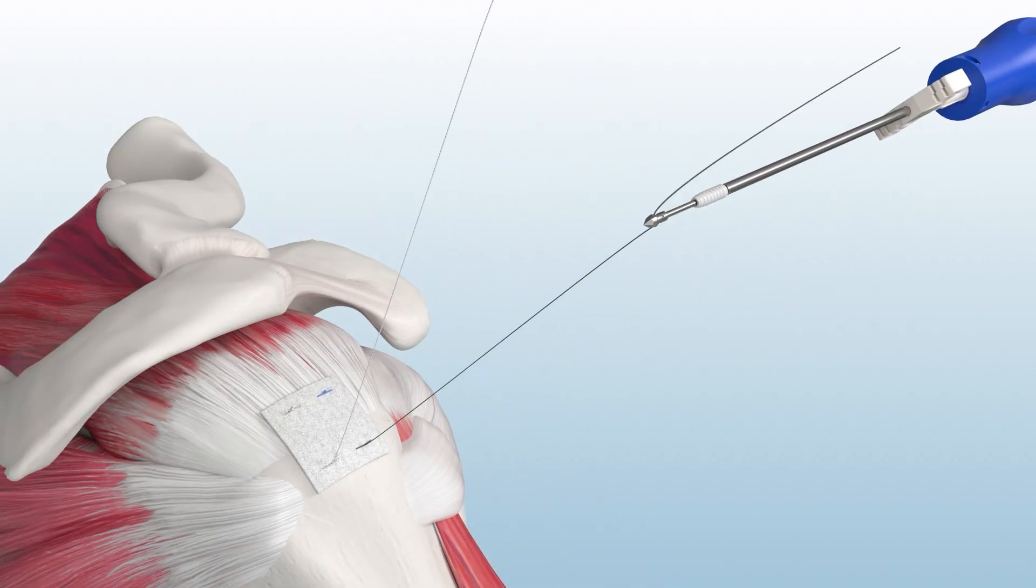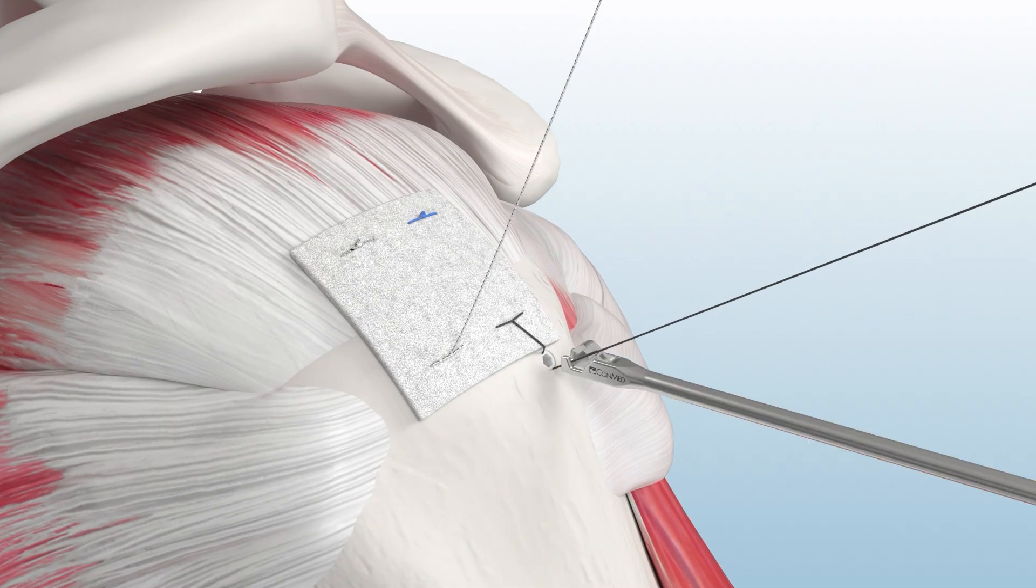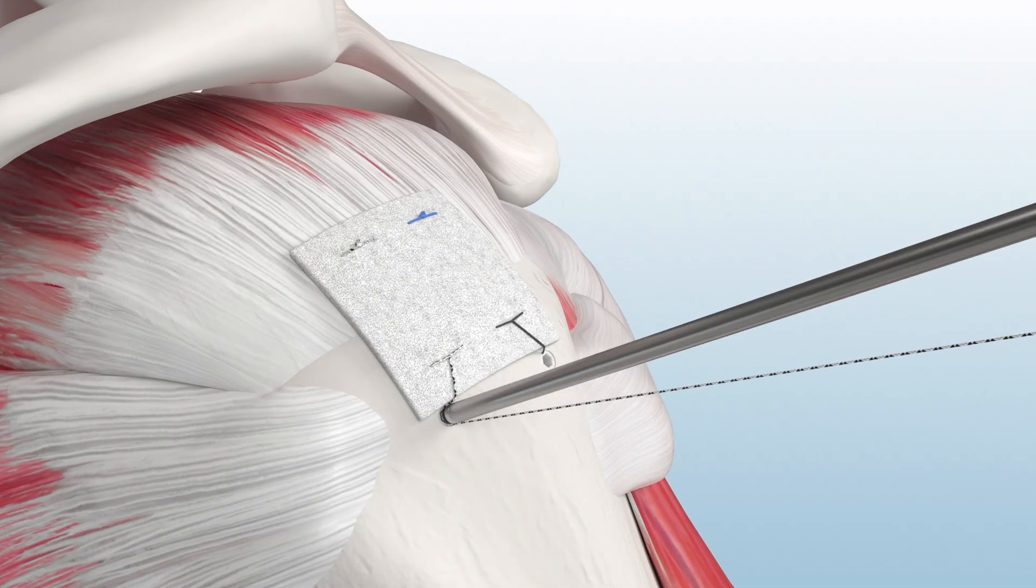Finally, secure each lateral suture limb using the Argo Knotless Genesis self-punching suture anchor to complete augmentation of the rotator cuff repair.